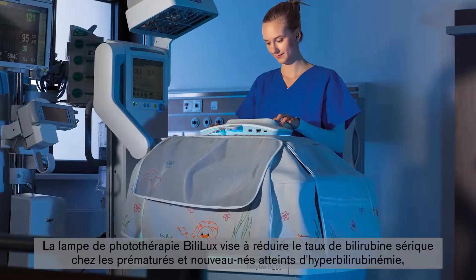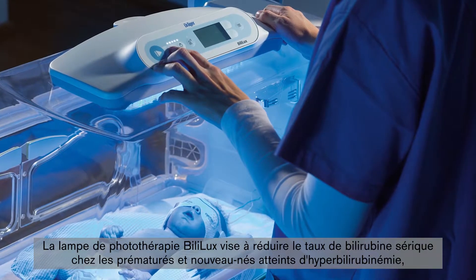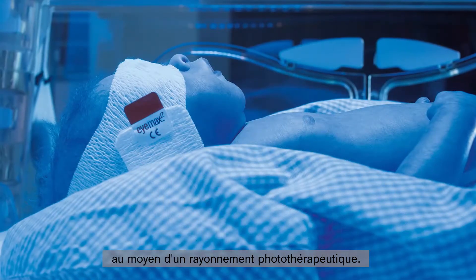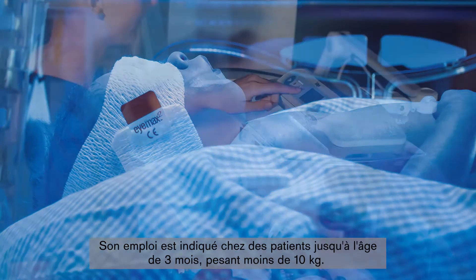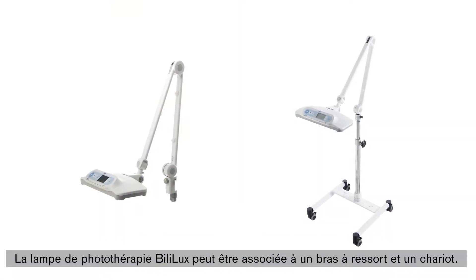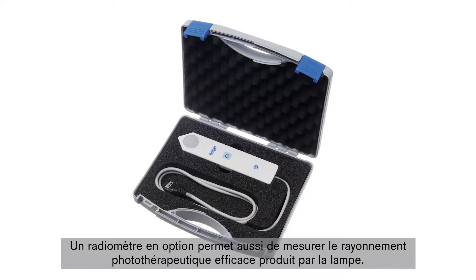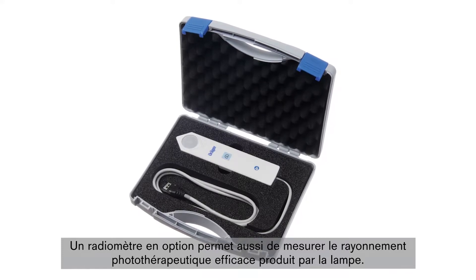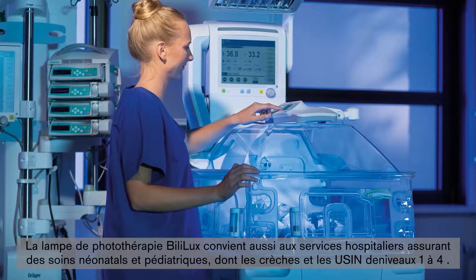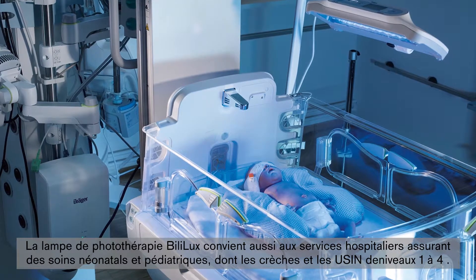The Bililux Phototherapy Light is designed to reduce the serum bilirubin concentration in premature babies and neonates with hyperbilirubinemia by means of phototherapeutic radiation. It is intended for use with patients up to 3 months of age who weigh less than 10 kg. The Bililux can be combined with a spring arm and trolley, and an optional radiometer is available to measure the phototherapeutic effective irradiance. It can be used in hospital departments that provide neonatal and infant care, including nurseries and NICU levels 1 to 4.